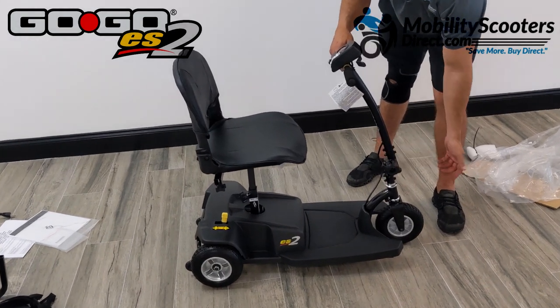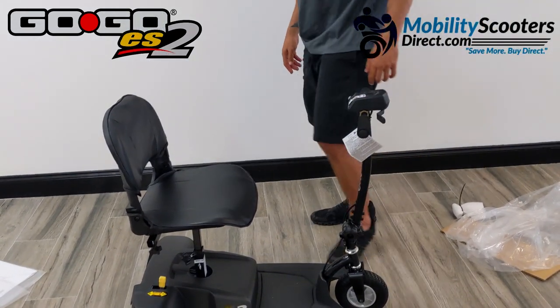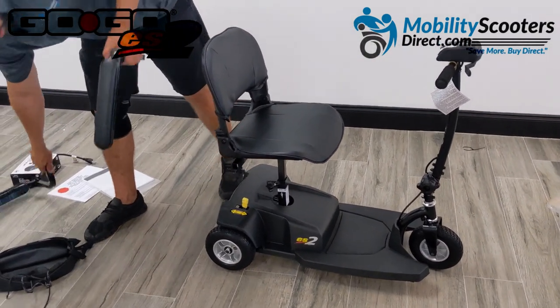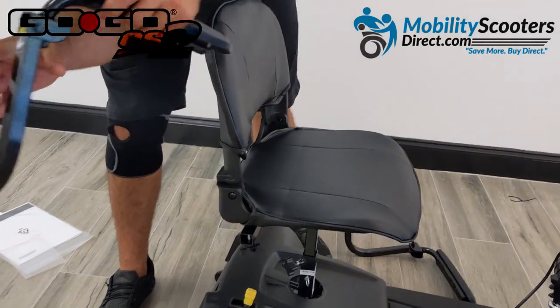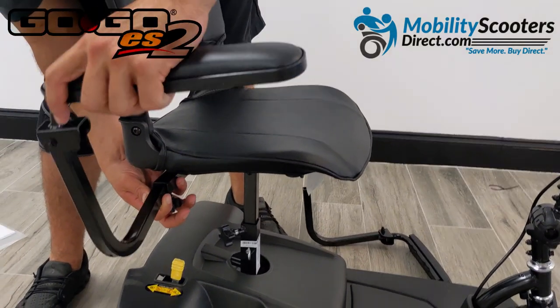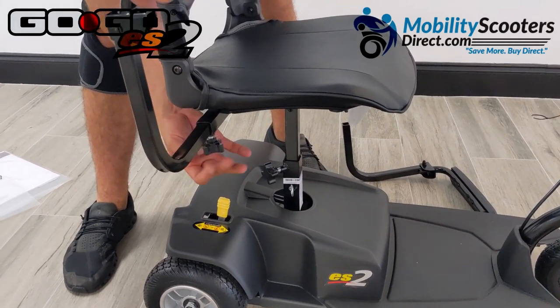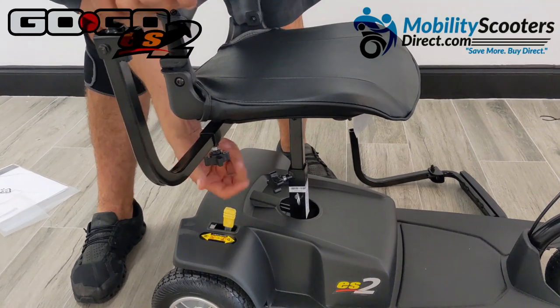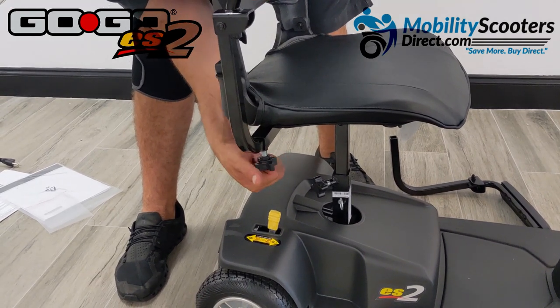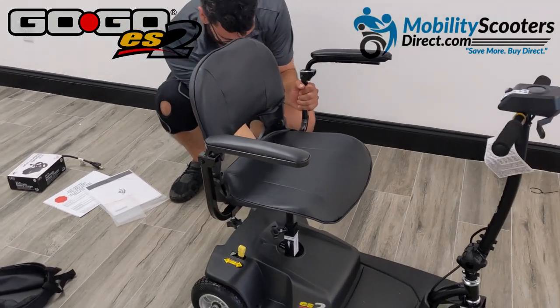On the front tiller you have another knob you can use to bring the handlebars closer to you or away from you. When the seat is removed, you can fold the tiller handlebar all the way down to make it easy to put this scooter in the trunk of a car. Make sure when you're done assembling that you tighten all the knobs. The armrests also have adjustment knobs — loosen them all the way to allow the armrests to slide into the sleeve, just like the seat post.